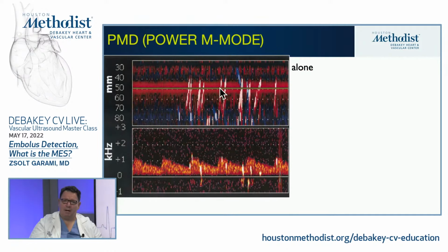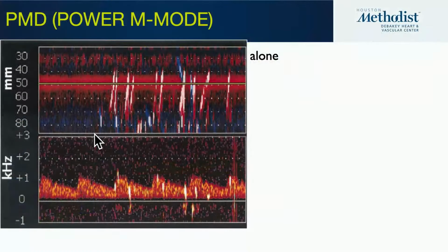But again, the power M mode is again this 33 channel. So 33-channel sampling, and the very important part is how you see the track of it, and that you see the spectrum signature. Here's 2. These are the 2 signals. What you see in M mode belongs to these 2 pieces. And what you see is this one is a little bit slower.